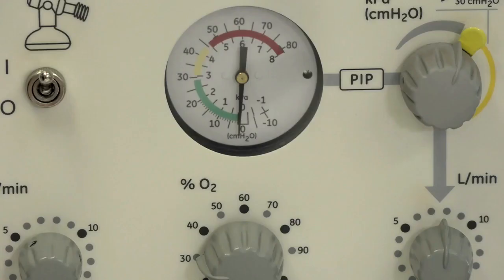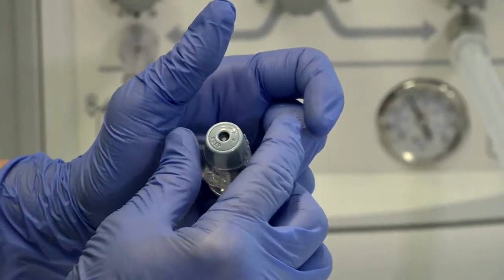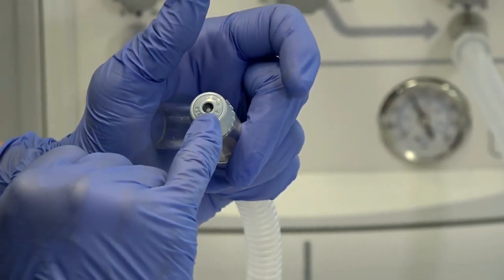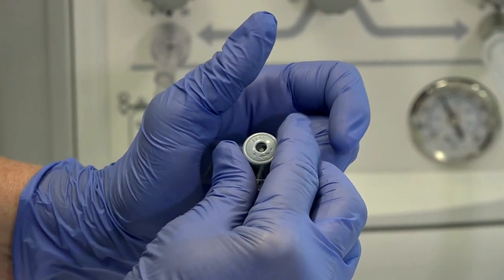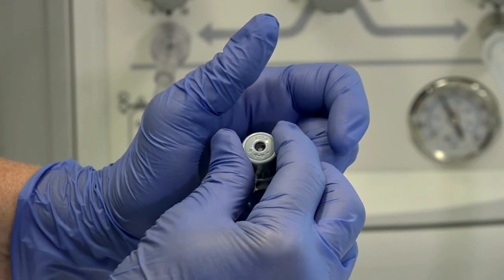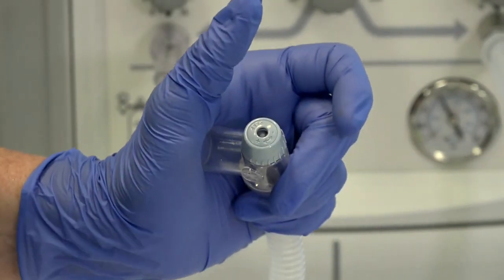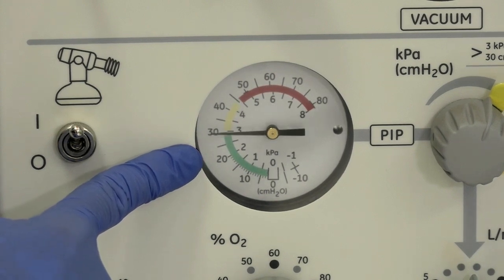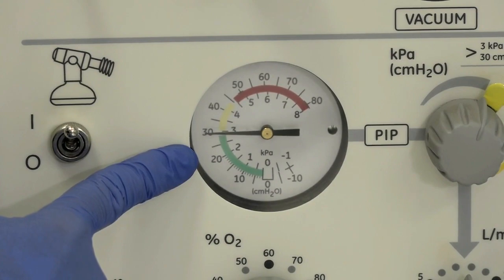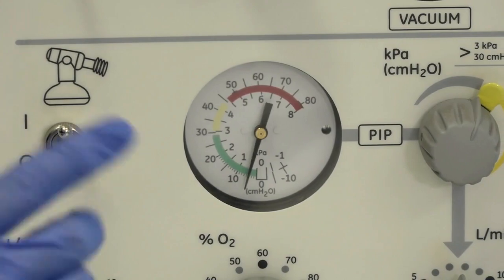Looking at the manometer, it's on zero. Turning it clockwise towards the positive — watching the dial — you can see it going up or back down. We are now on 5 centimetres of water, which is what the WA Addendum specifies. We then verify our settings by occluding the T-piece and releasing a few times, and then we're happy that our setting is correct.